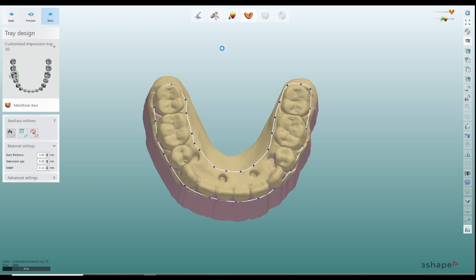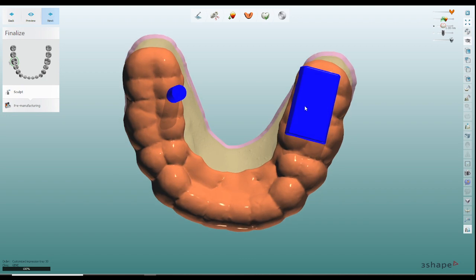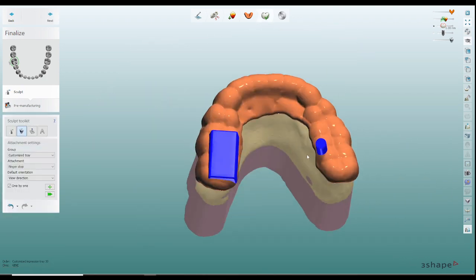When we click on next it's going to create a nice custom tray that fits right on top of it. There's no impression gap so it's nice and intimate fit and what I do from there is you can see a preview of what I did here.